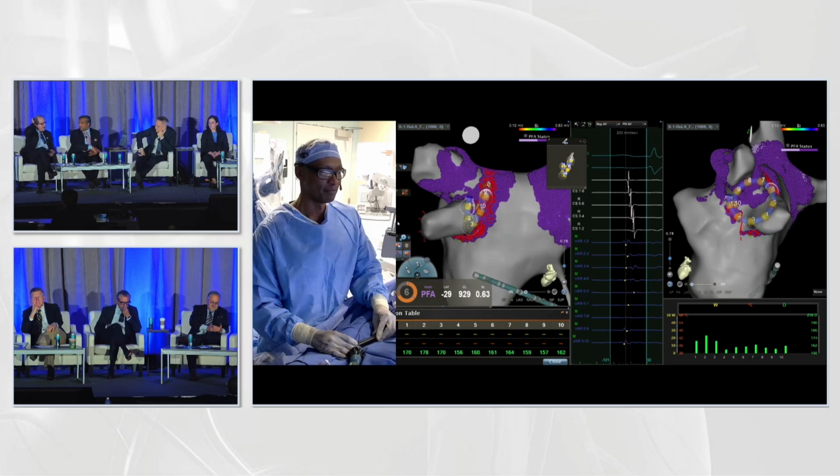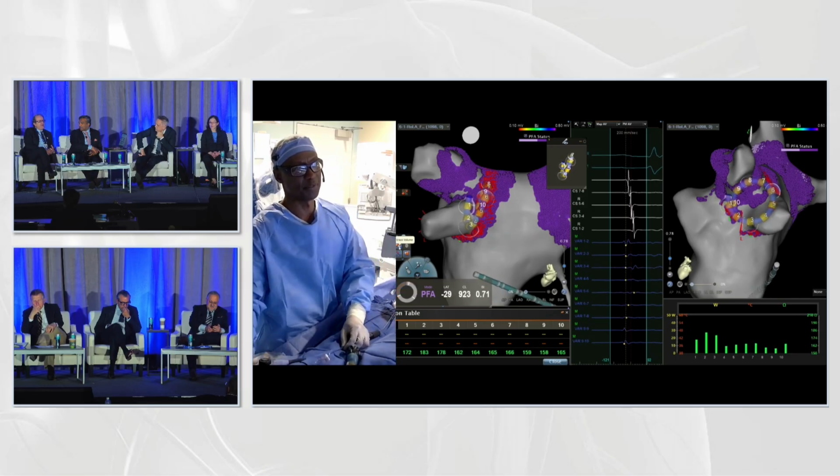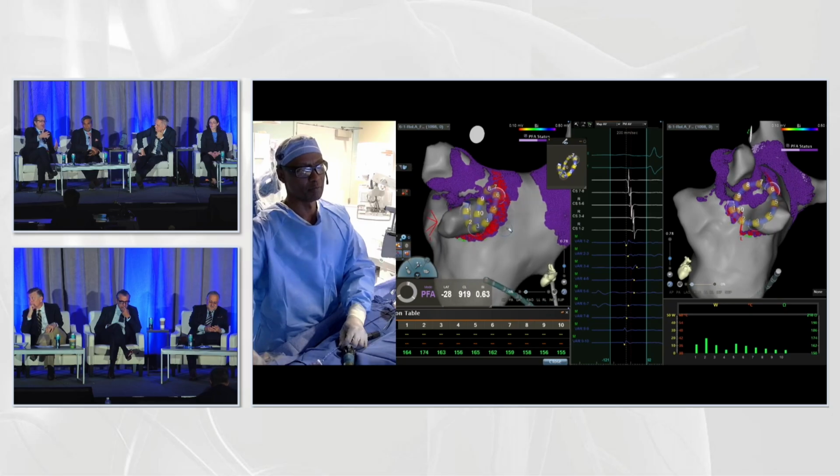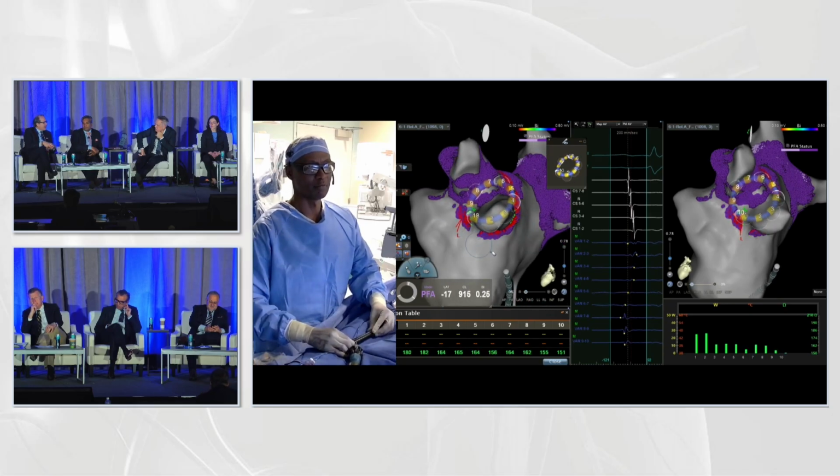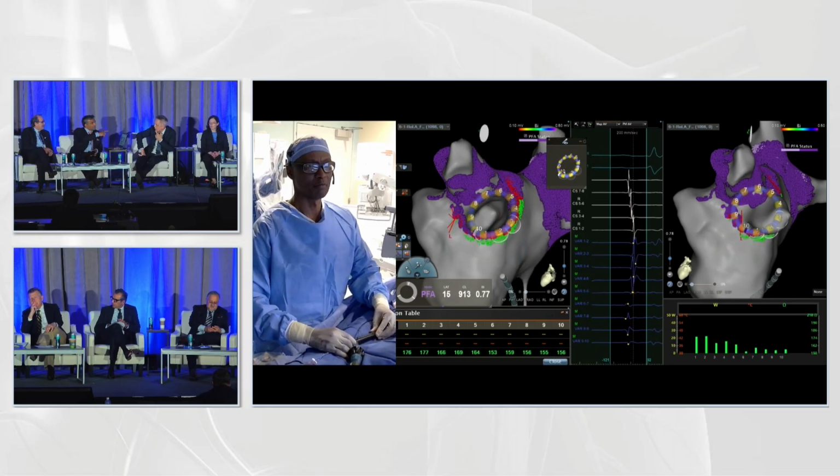One question for the panel is that with this specific technology, I have not seen much of the vagal response. I don't routinely apply glycopyrrolate, which I actually do with other technology. So any experience from the panel in this? Daniel, you want to comment?